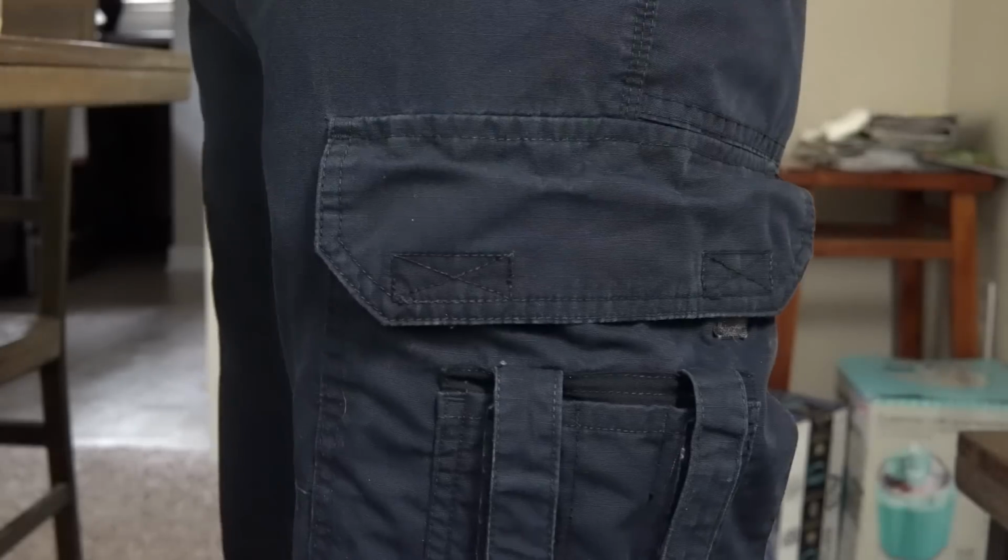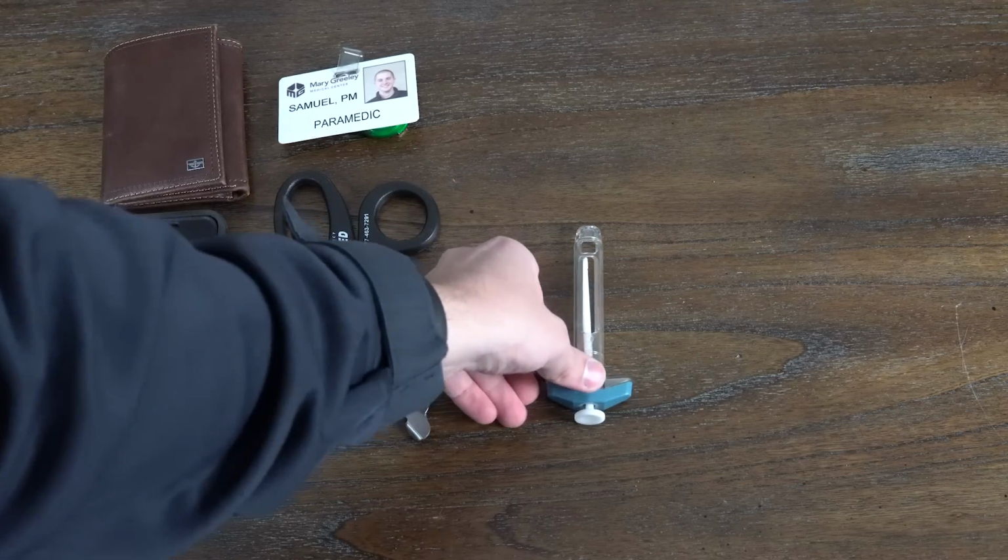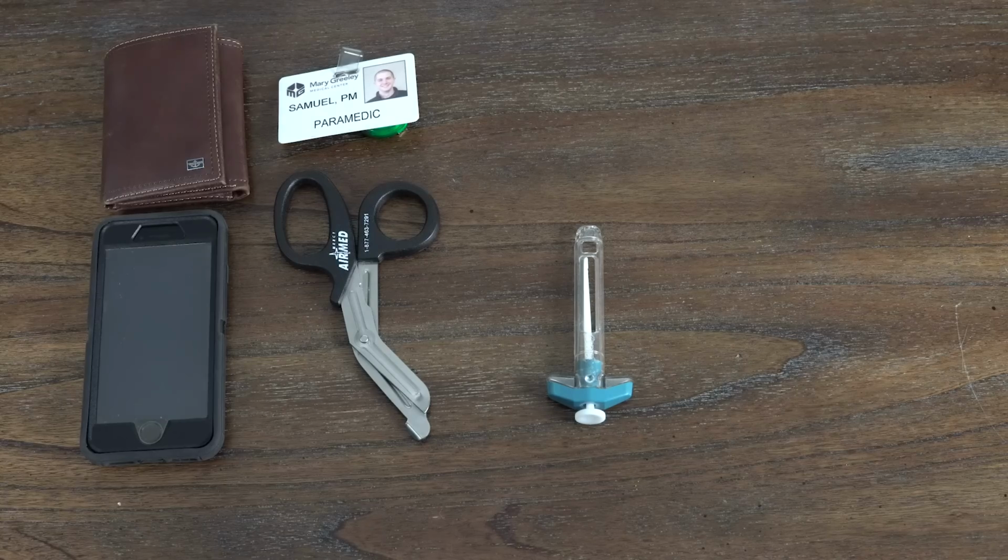Next to those, I carry two things. I carry a Carpiject, which is for medication administration. There's a kind of medication that needs this put over it to push it. And because I work for a hospital-based service, they buy whatever's the cheapest medication, and it comes in many different forms. So you can open the med box one day and your fentanyl will be completely different, for example. So although they do supply these in the med box and we have some in the ambulance, I can never find them when I need them, and I found it a lot easier just to carry one in my pocket.